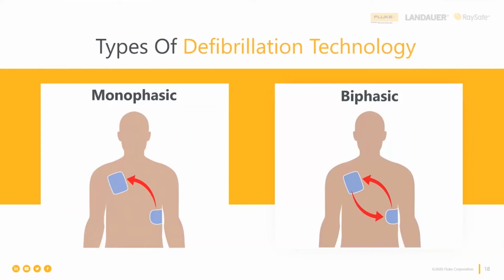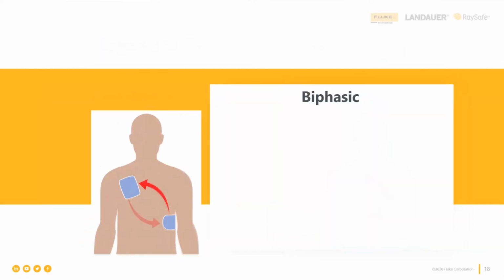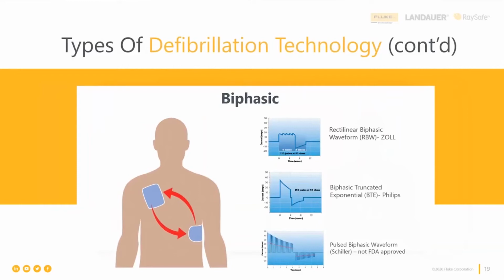And sometimes we might, I don't know whether we'd set testing limits on those because there's no pass/fail, but in terms of understanding across not only the 50 ohm standard load that's built into our defibrillator analyzers, but any other load that we're able to present to the defibrillator at a particular energy level, to make sure that we see the appropriate amount of time in order to get the current into the heart. All right, so that's kind of what we're looking at. Let's take a look at some of the different waveforms.